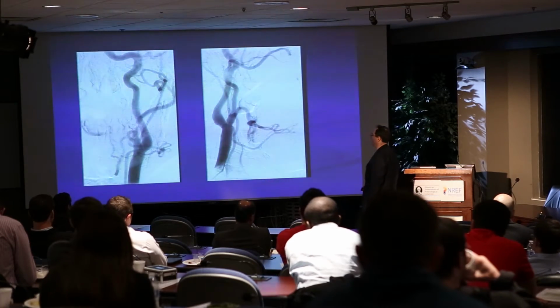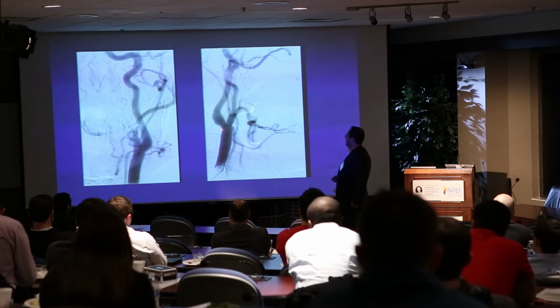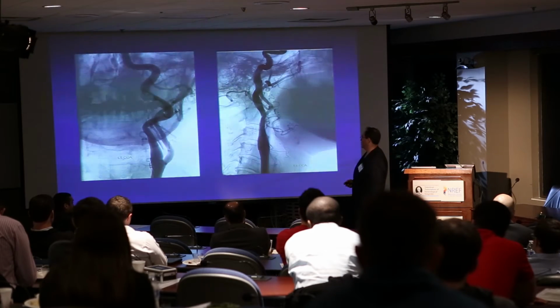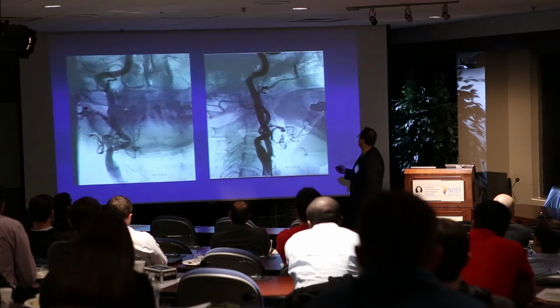And it's good to get an idea. Obviously, the carotid bifurcation. Most patients will have a mild degree of atherosclerosis, but you can see more pronounced types of things. Is this the one? Next one.